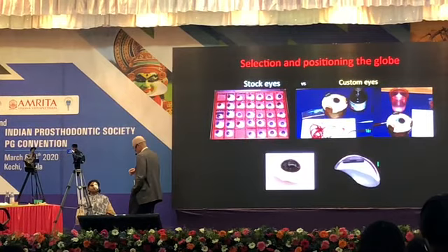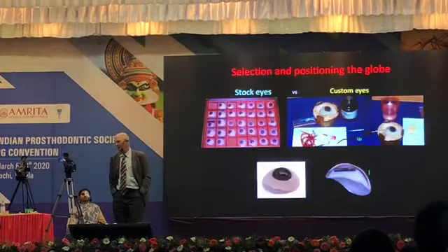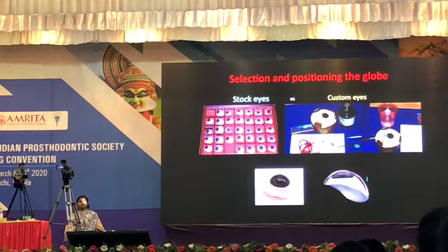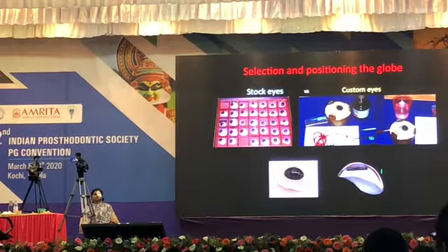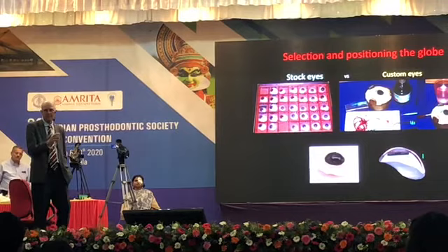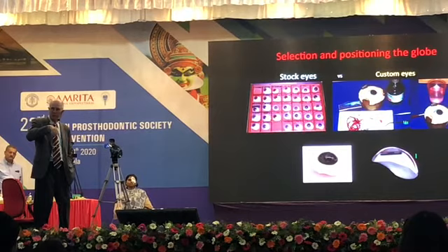So it's actually, this isn't quite set yet, but this patient was a perfect patient, really, to demonstrate on, because the globes were too small, and we couldn't quite do what we wanted, and the prosthetic space was not sufficient. And so you'll see when I try on the sculpting that it doesn't really look real. And it's because of the lack of depth. We couldn't create the depth and the shadows around the eye that she has on the opposite side.